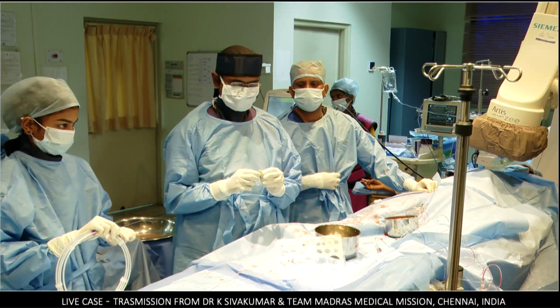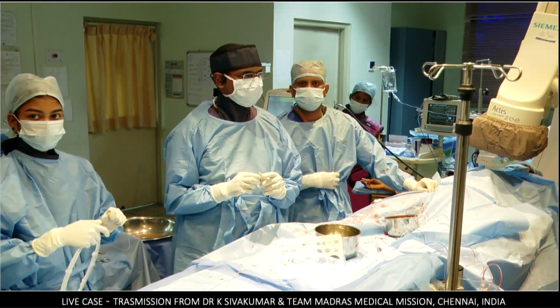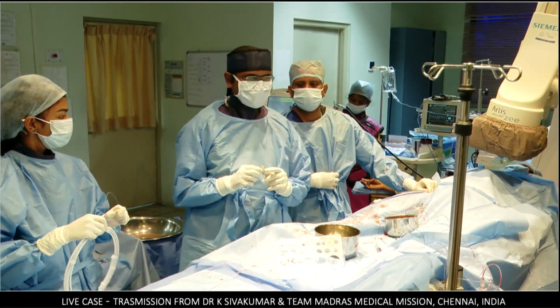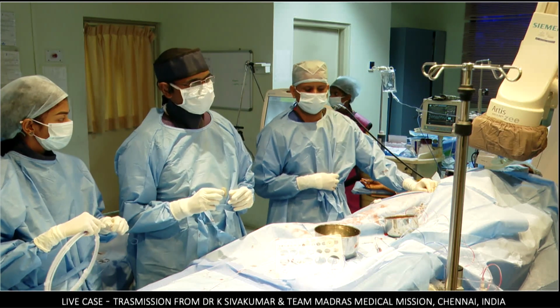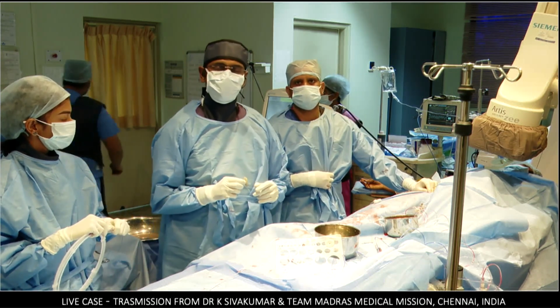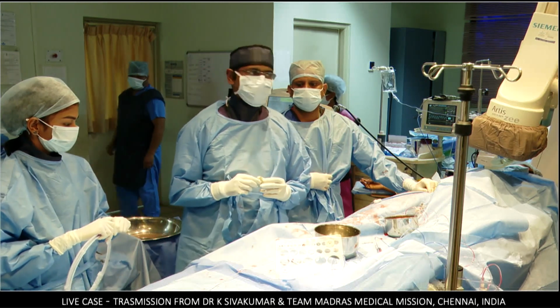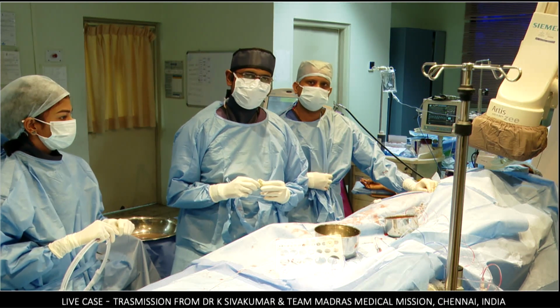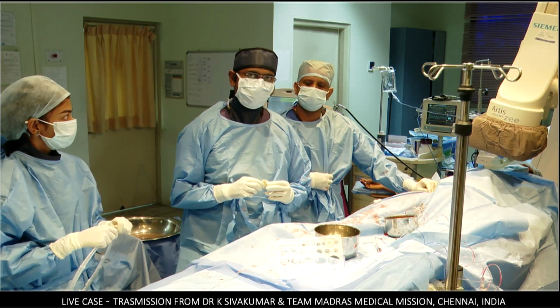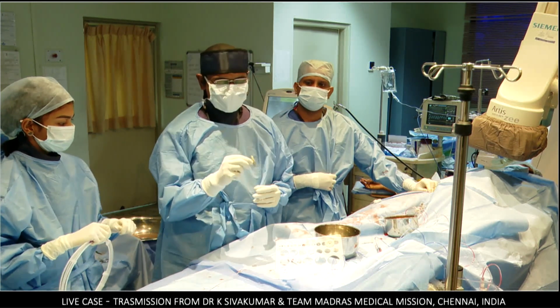So, just to be clear, you haven't used the device before. No, this is the first time I'm using it. We just got the regulatory approval, and it's a very new device. It has not been used anywhere in India. I heard that Dr. Tin from Vietnam had used it on about 4 or 5 patients. I'm just slightly worried that you're a bit further away from the table. If you drop it, then what? I'm securely holding it.